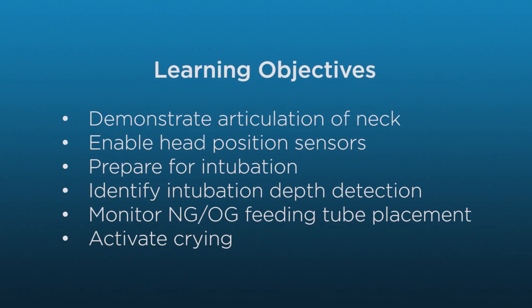By the end of the video, you will be able to demonstrate the articulation of the neck, enable the head position sensors, prepare Supratory for intubation, identify intubation depth detection, practice naso and oral gastric feeding tube placement, and activate crying.